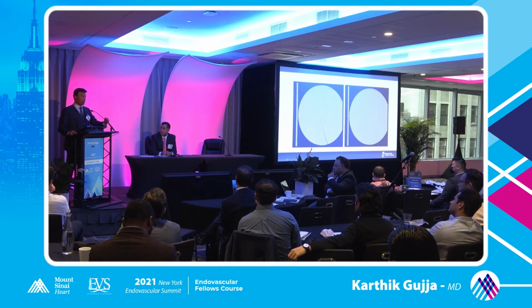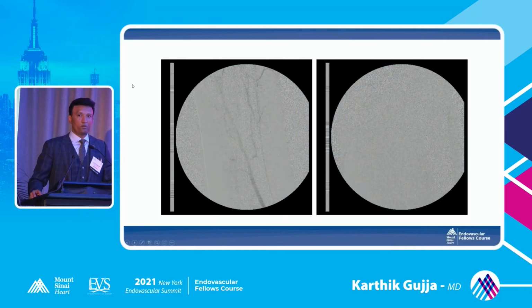There are a couple of filters, some of which are not FDA approved. Actually, now both the filters are. Correct. Yes, that's true. So initially, Medtronic had a SpiderFX filter, which was approved from the beginning, but now Abbott has an EmboShield filter, which is approved now. I think that just happened last year, if I'm not wrong. Right? Yes. Okay.